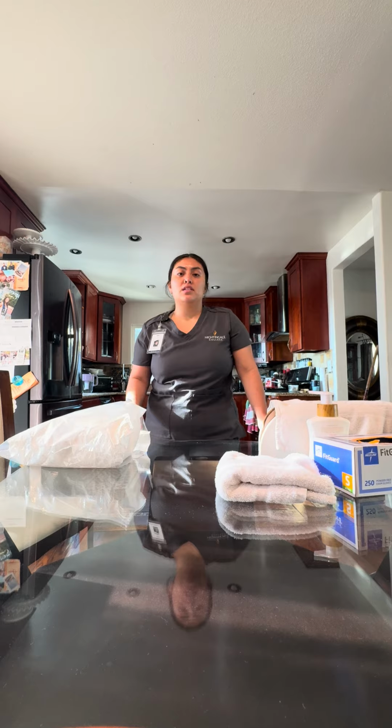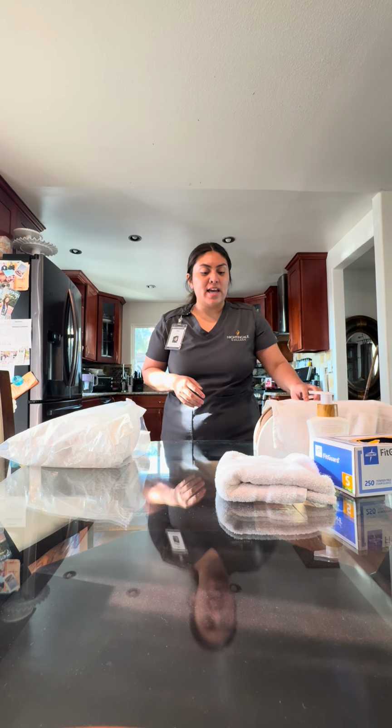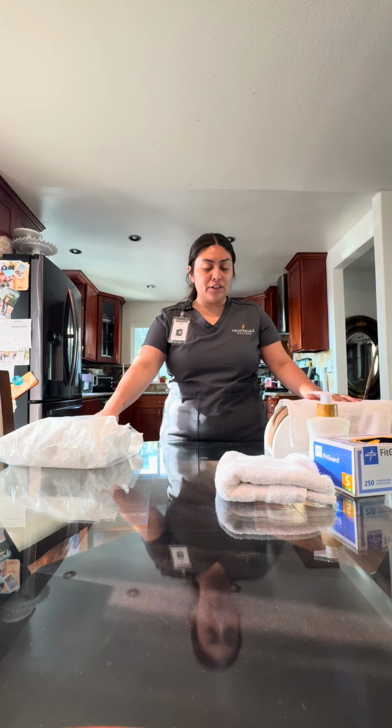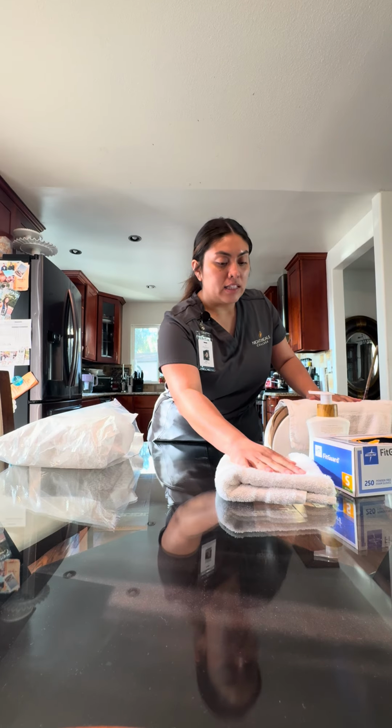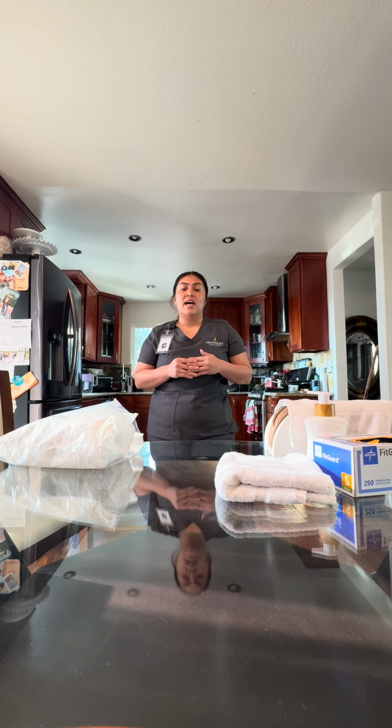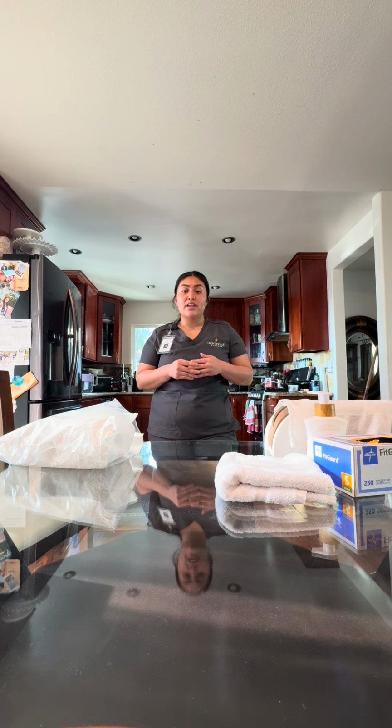Hello, my name is Jolene Castro, and today I am creating this recording for remediation of an insertion of a Foley catheter on a female patient. I've gathered my supplies. I have my patient who is covered, my Foley catheter kit, some clean washcloths, my hand sanitizer, and some clean gloves. For remediation, this video will begin after cleansing the perineal area.